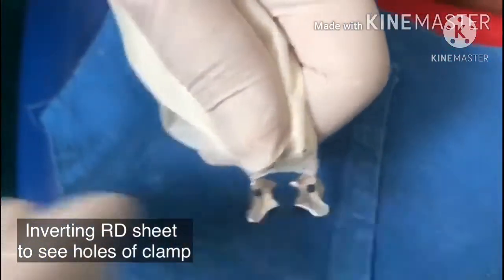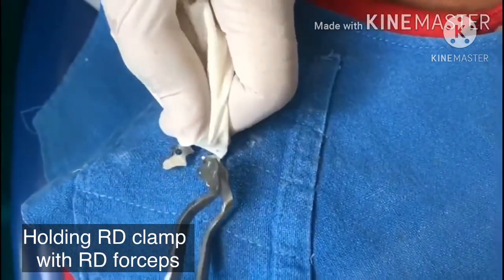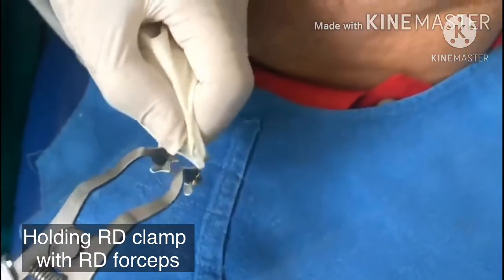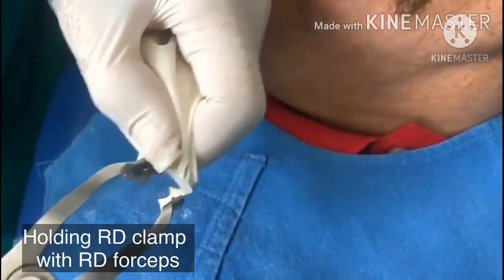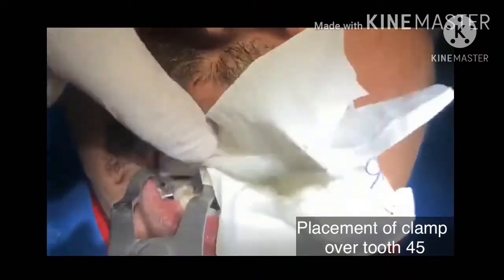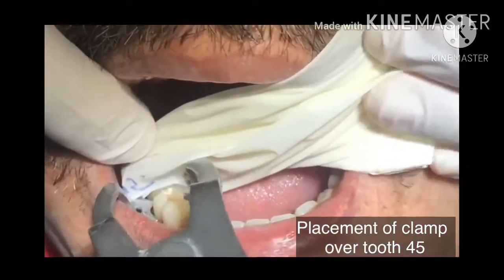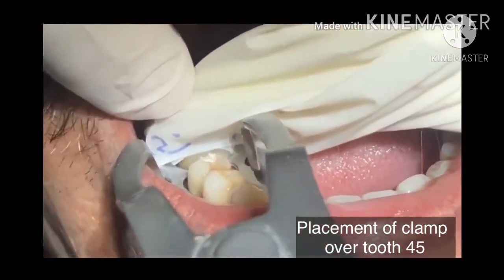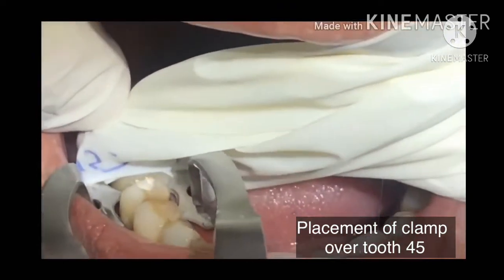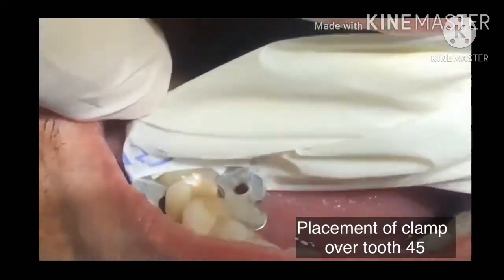Now you see the two holes. In the two holes we put the rubber dam forceps. We can expand and then it can clamp below the teeth and leave it. See that it is not pinching on the gum. We can always ask the patient — is it pinching on the gum? She says no, so I am safe.